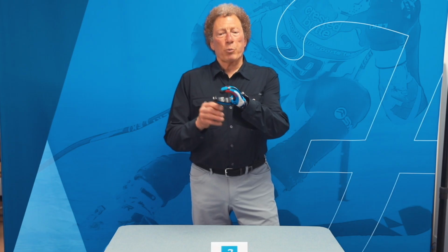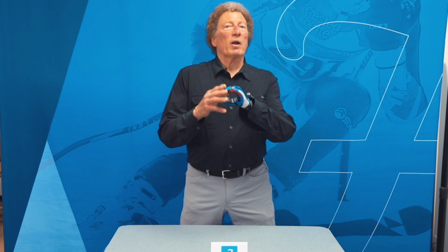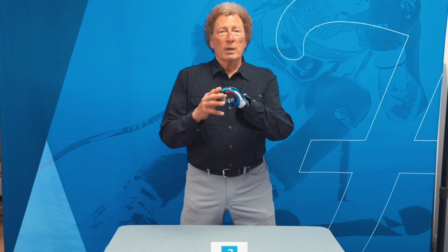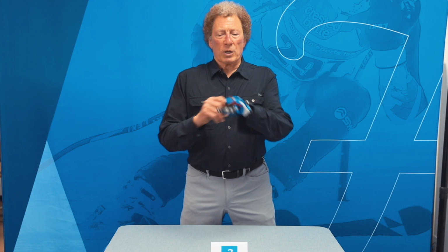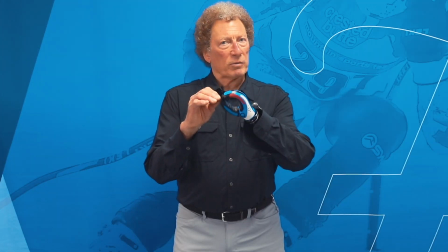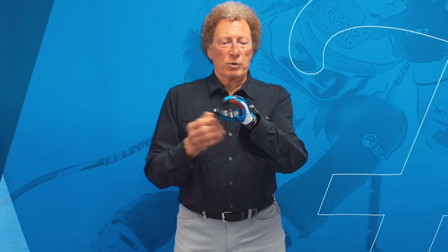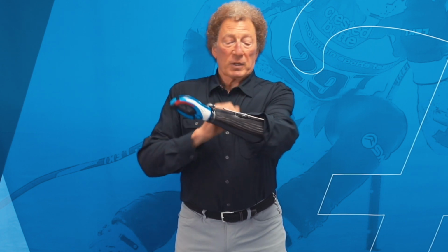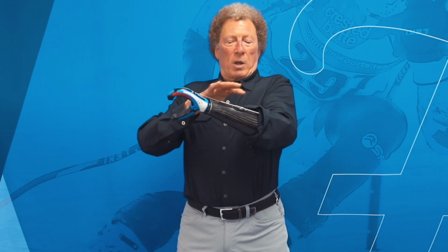So one of the things I'd like to point out that's really important about any device that you're putting on that's voluntary closing in particular, but is really applicable to all body power, is how you're going to control this cable. With voluntary closing, of course, you have to maintain tension. Now this prehensor is over 90% efficient, but what we have now is a system called a Sherlock, and this is one of two models that I have. This Sherlock is built in here.